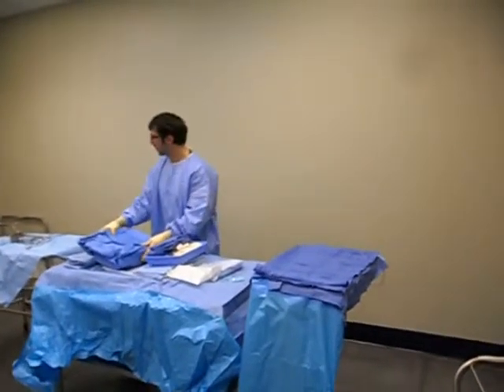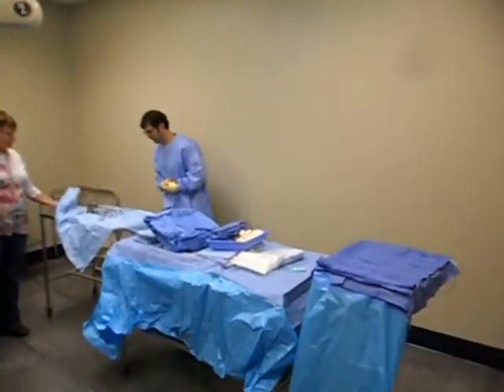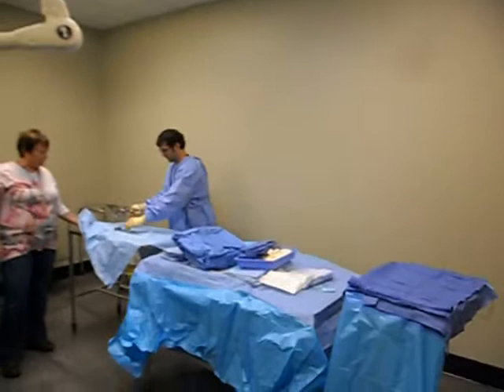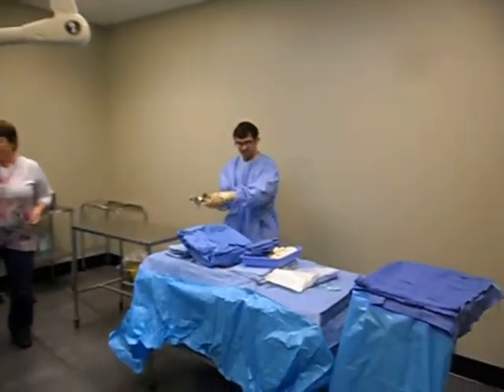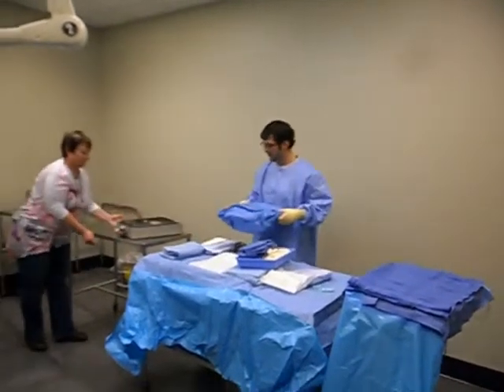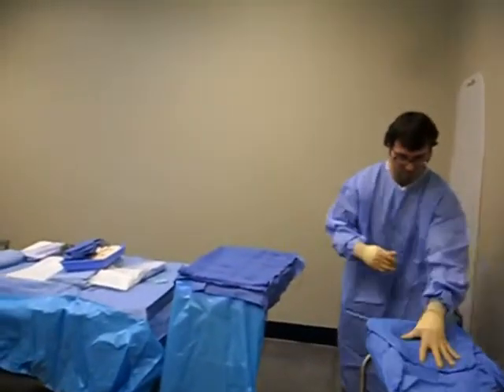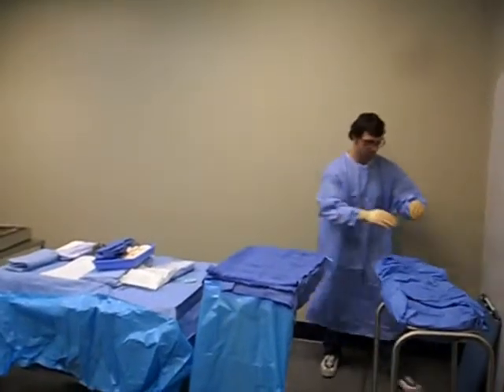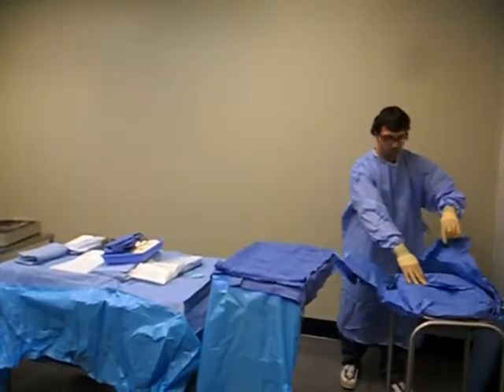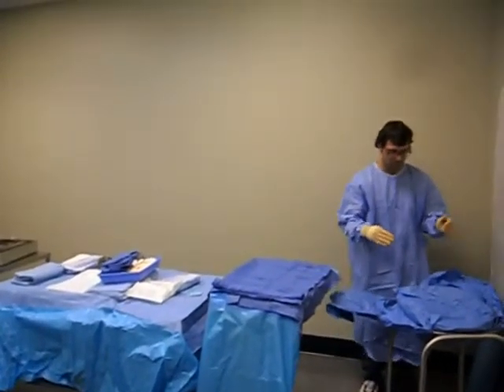Okay, you probably want to take this so you can get this table. Yes, this one. Just carefully come over here. We look for an indicator, go ahead and take that. Indicator, it's not wet or anything. Over here. Now, you would not want that to touch the wall, I should say, but we're in close quarters here, so do your best, but you would not want that to touch them.